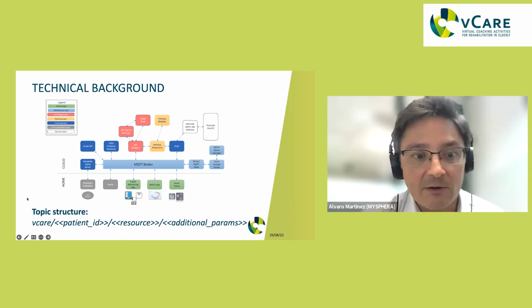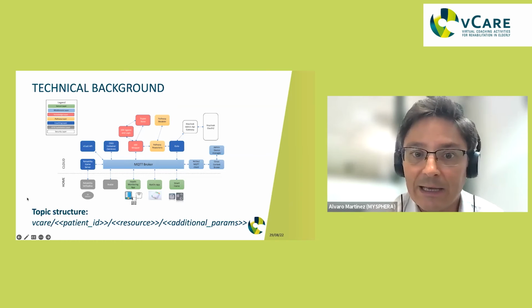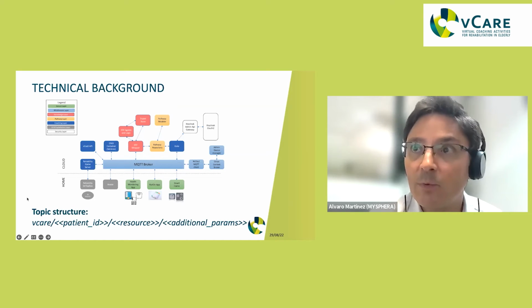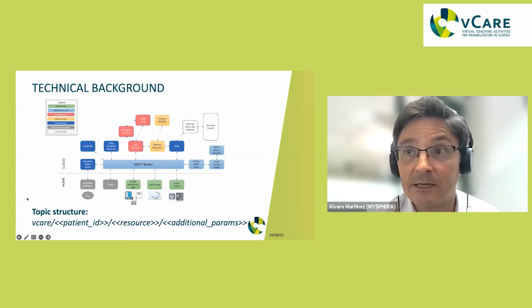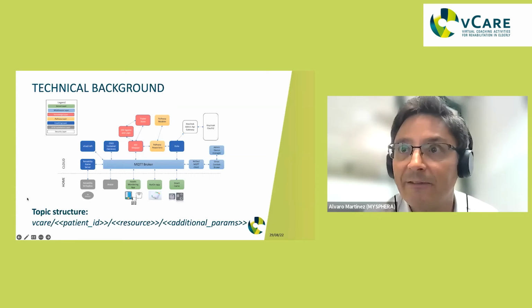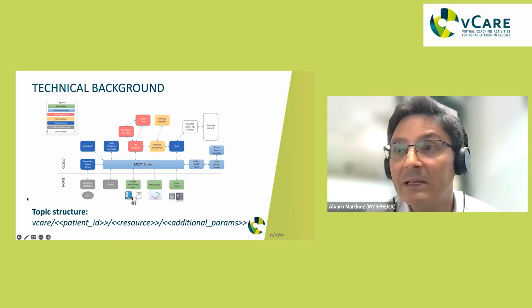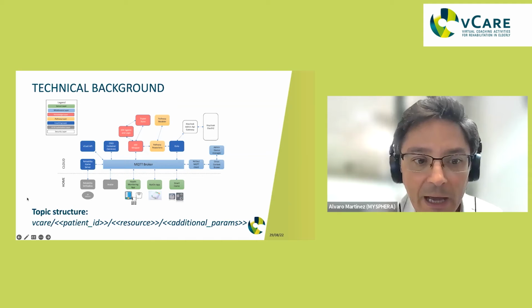As depicted in the picture, you can also see that this architecture is distributed. So we have a cloud part where all the shared services are hosted, but we also have an edge part which is replicated at each of the patient's homes, which hold all the point of care devices and all the integration devices.